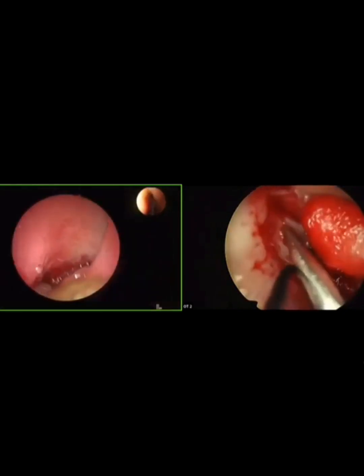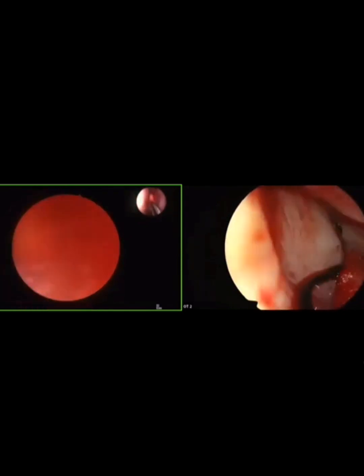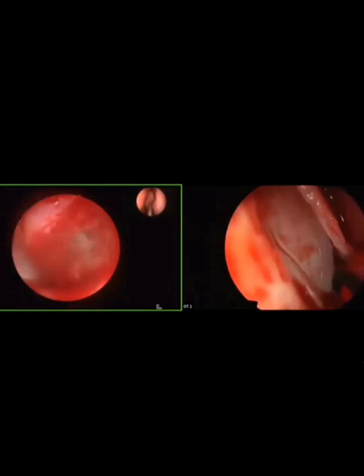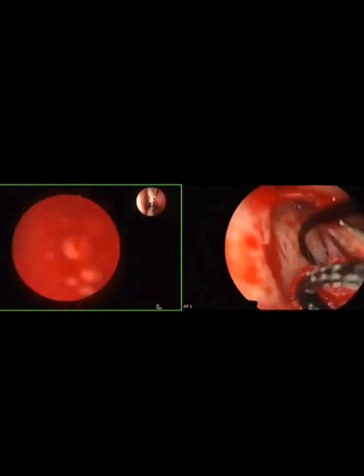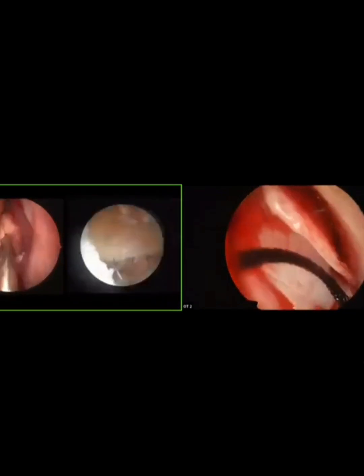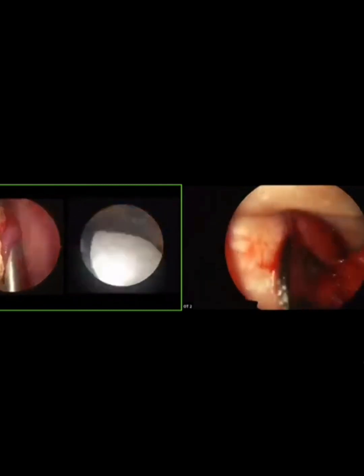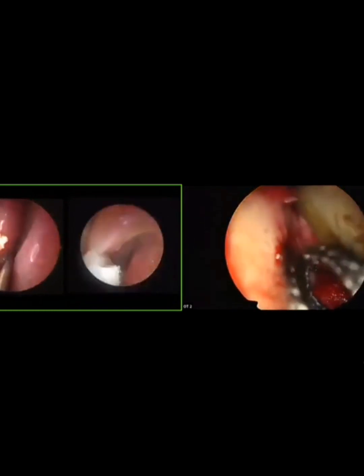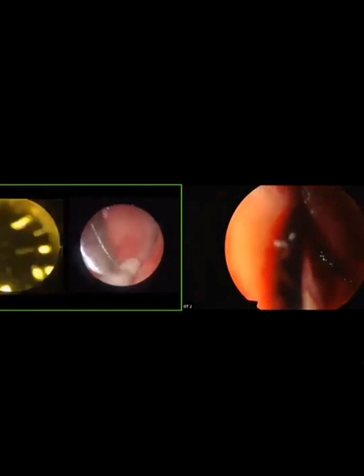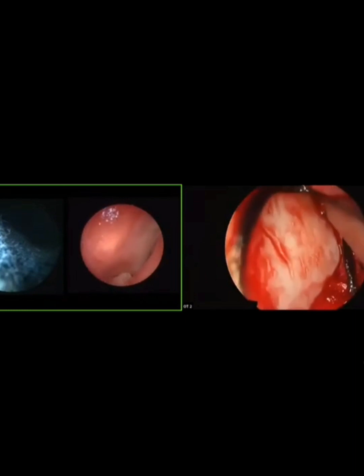Wash. Ready with wash. Wash. I'll wash the maxillary sinus to clear that pus. Still there is pus, okay. Use merocel, big merocel, please. I will insert big merocel, half of the piece, okay, inside the maxillary sinus and mop the maxillary sinus to clear that pus. This is half piece of merocel. Suction, out suction. Out suction. Thank you.